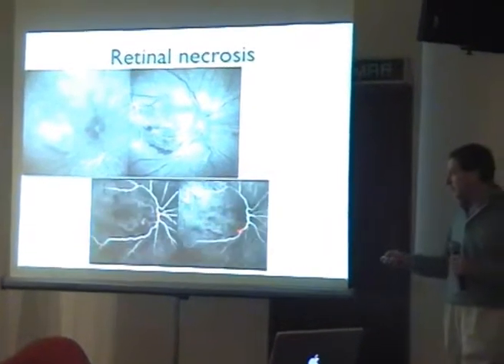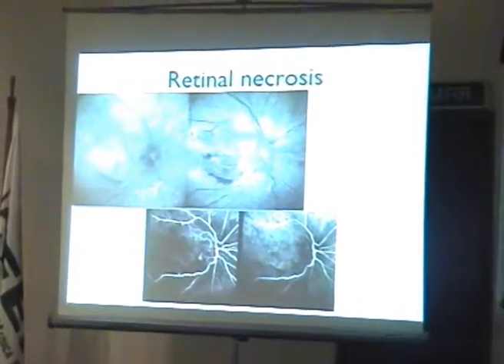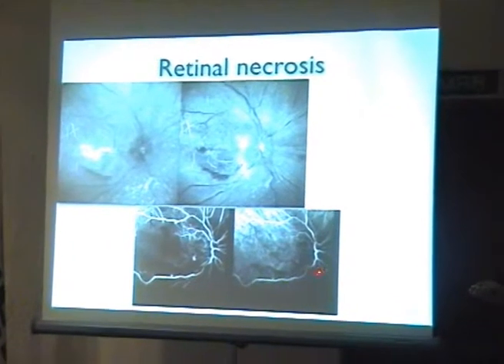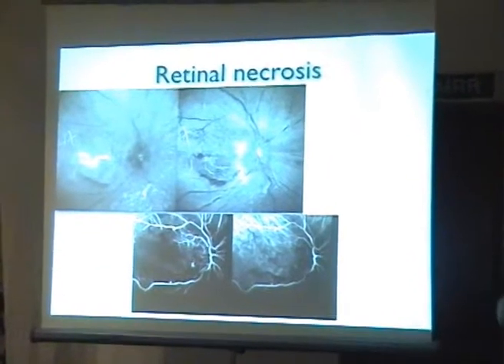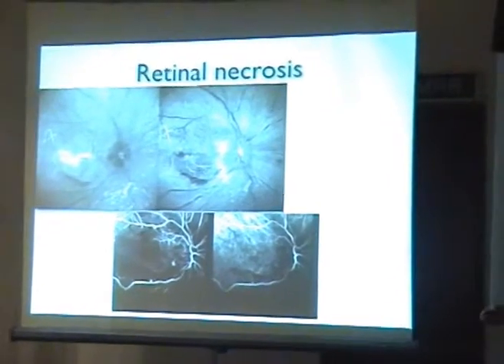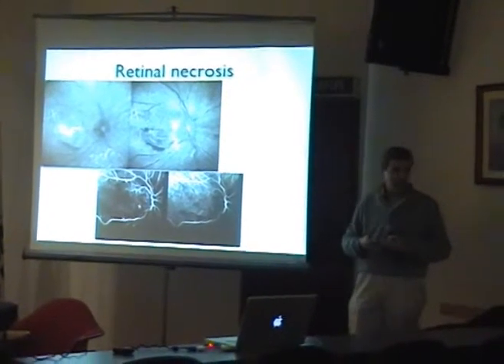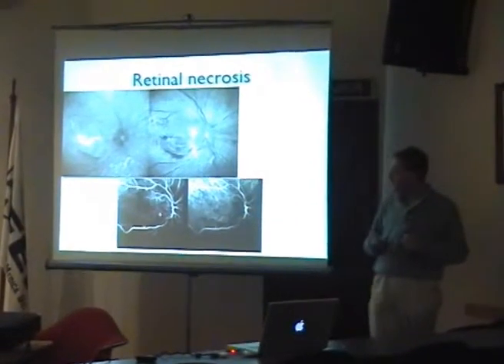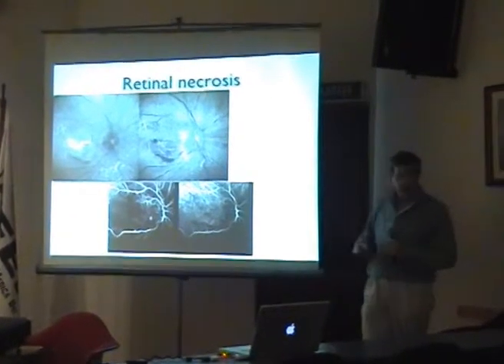This is a sad story of a patient that had retinoblastoma in one eye, the left eye. Then after 25 years, she had a glioma, was treated for glioma, and had neurosurgery. She did very well, but she underwent chemotherapy. After the third cycle, one morning, she woke up and was completely blind.